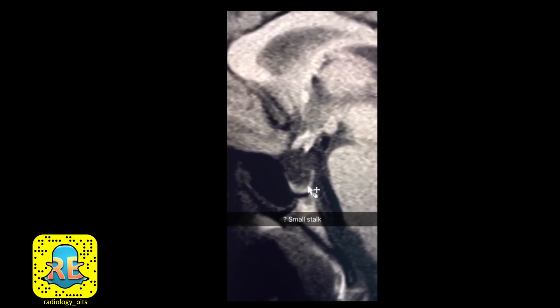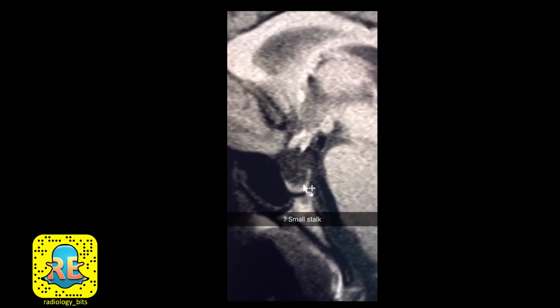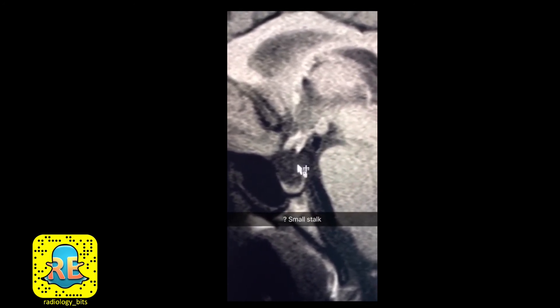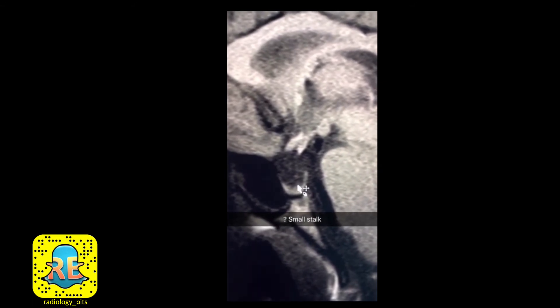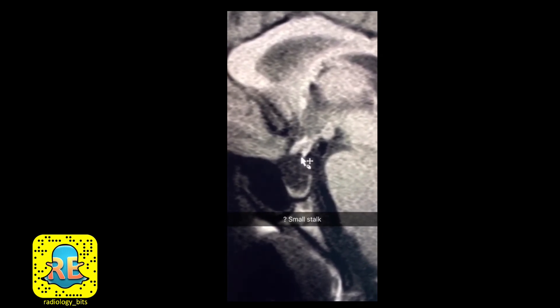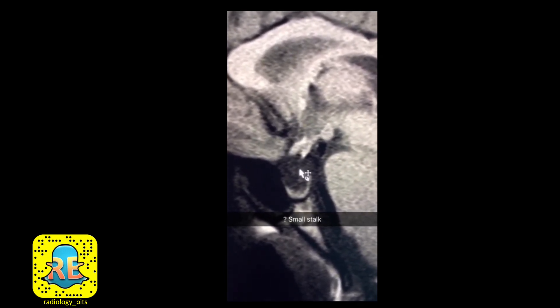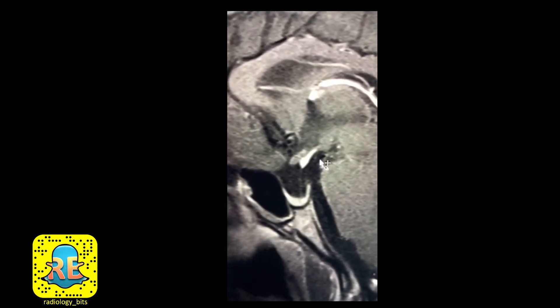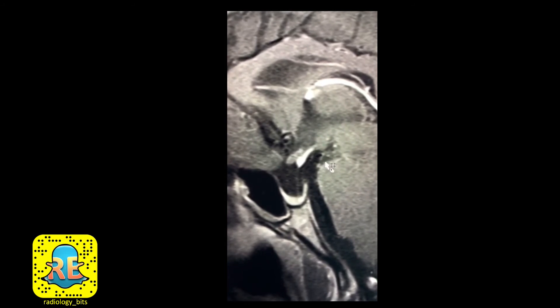The third component to look for is the stalk. It is very difficult to appreciate here, but the pituitary stalk might be represented by this very thin line — which is not normal. It should be a bulky stalk, as we saw on the prior normal case.